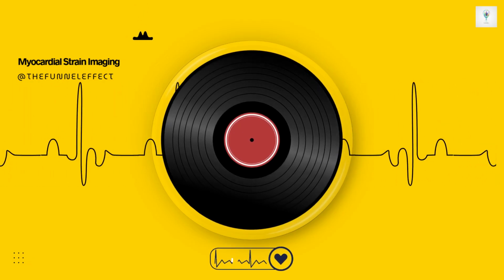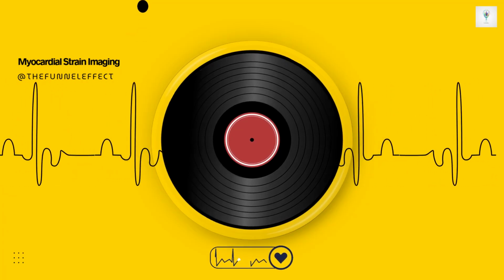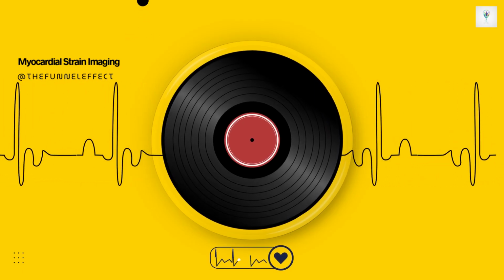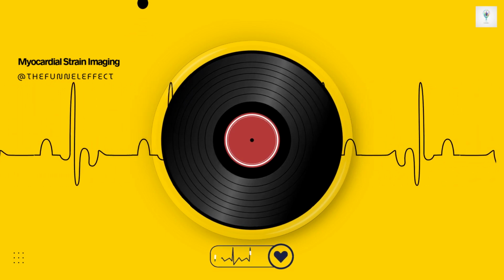That limits our ability to accurately assess that crucial relaxation and untwisting of the heart. The authors note that using higher field strength magnets, like 3.0 Tesla systems instead of the older 1.5T, can help a bit by making the tags last longer. But it's still a limitation.